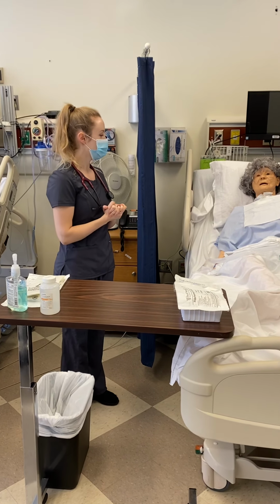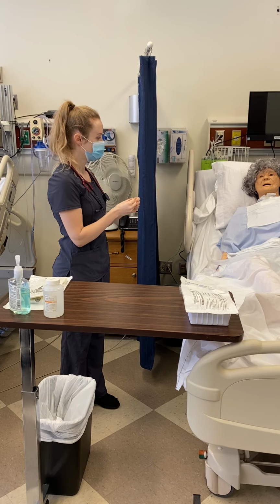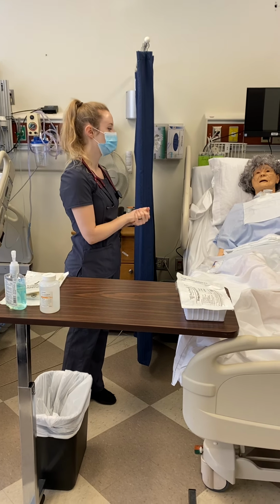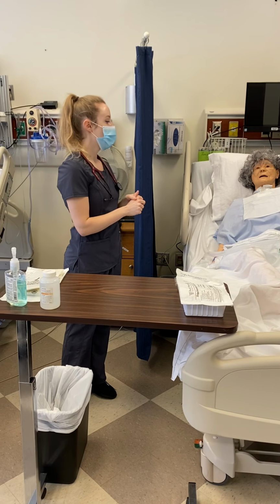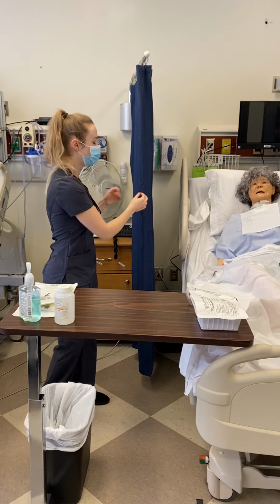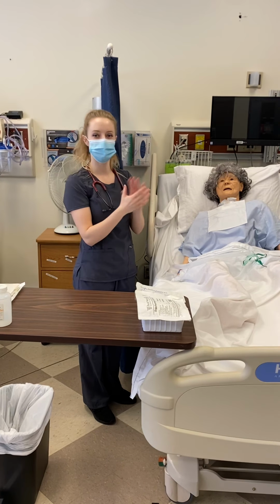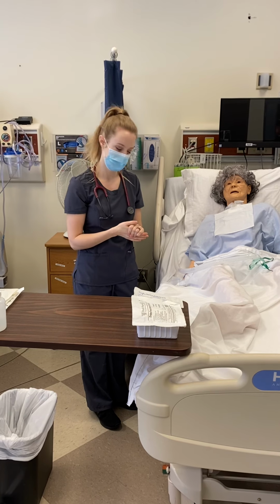First I want to knock. Hello, my name is Grace. I will be your nurse today. I'm going to do some suctioning, and I'm also going to clean and replace the bandage on your tracheostomy. Perform hand hygiene. I want to provide client privacy and ensure the bed is in a semi-Fowler or Fowler's position.